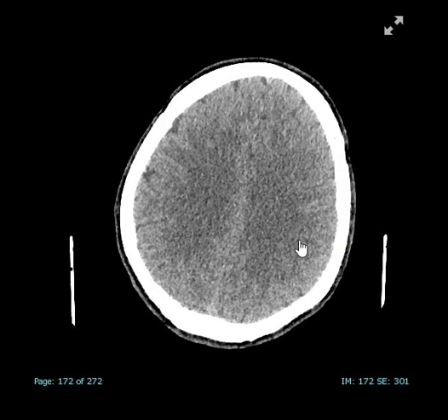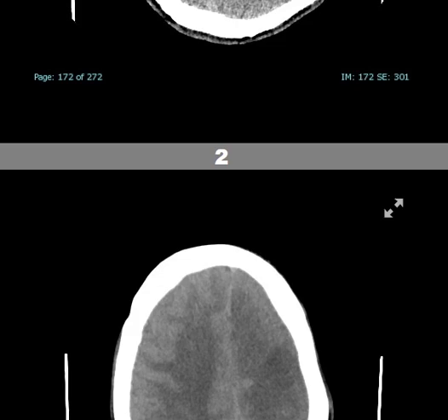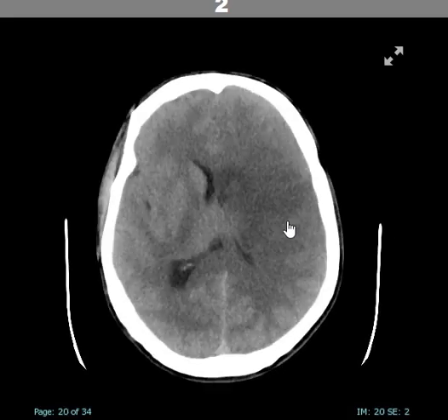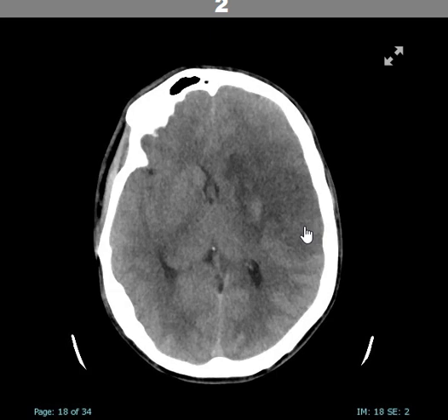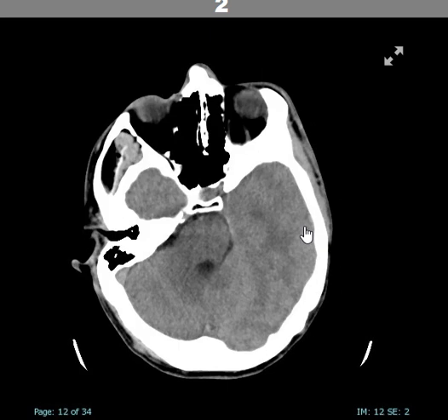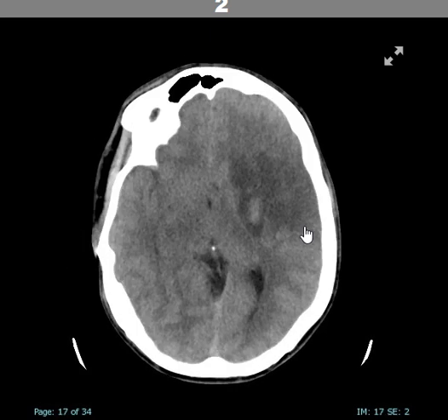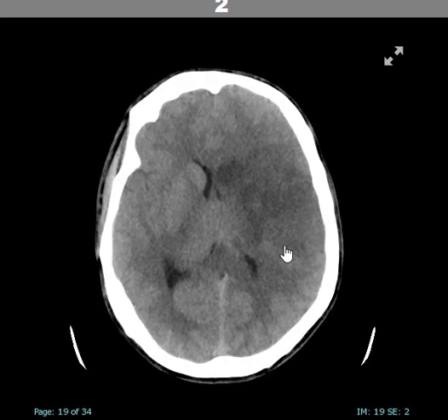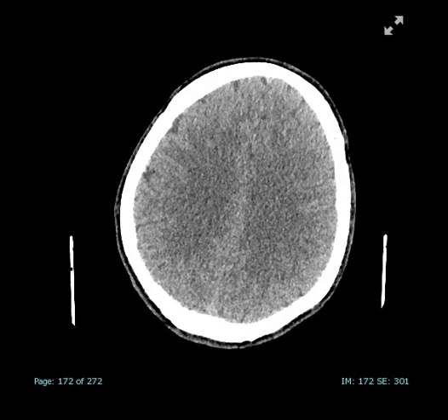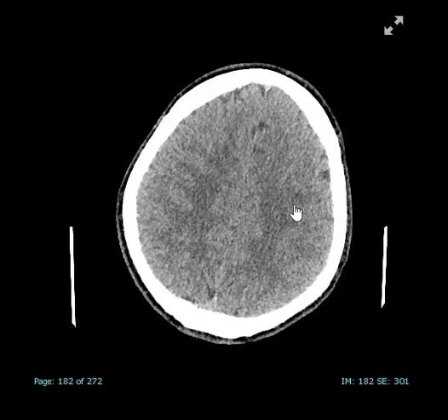Why am I saying such subtle things? If you don't believe me — same patient, a few hours later, wasn't treated. Look what's happened. Now anybody can pick this up. But that doesn't take a genius to pick this up at this stage. This is a young guy who's had a massive stroke and it really should have been picked up at this stage.